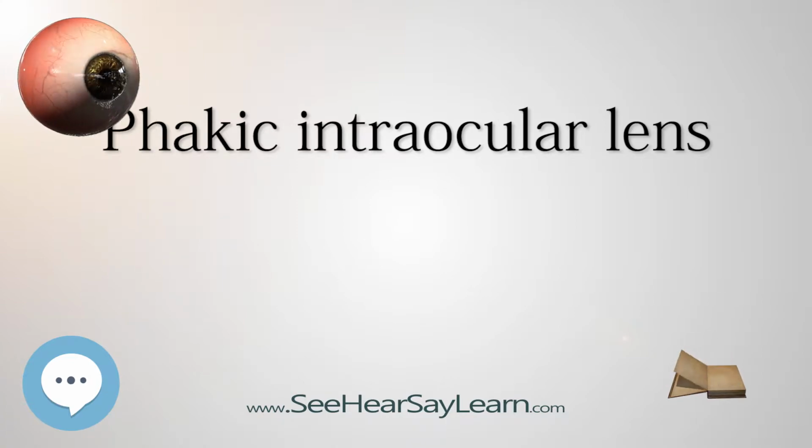Although PIOLs for hyperopia are being investigated, there is less enthusiasm for these lenses because the anterior chamber tends to be shallower than in myopic patients. A hyperopic model ICL, posterior chamber PIOL, is available. Corneal endothelial cell count less than 2000 to 2500 cells/mm² is a relative contraindication for PIOL implantation.